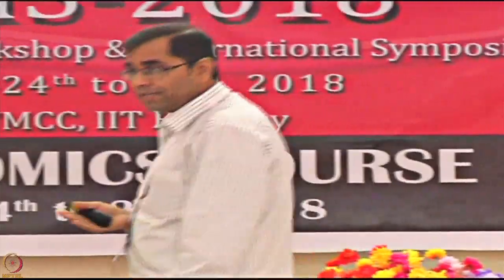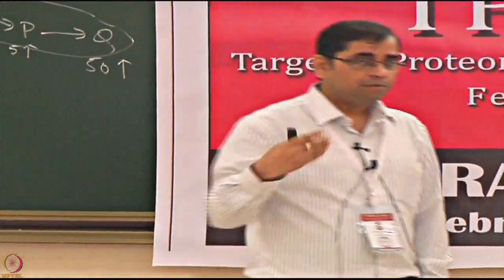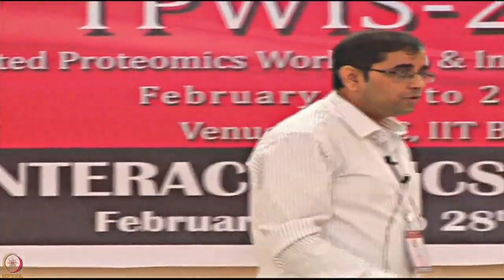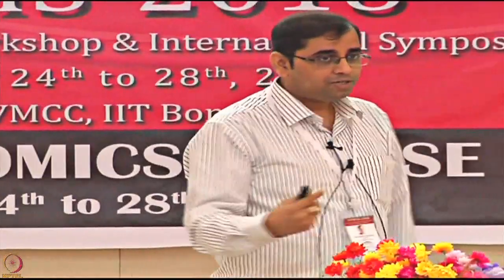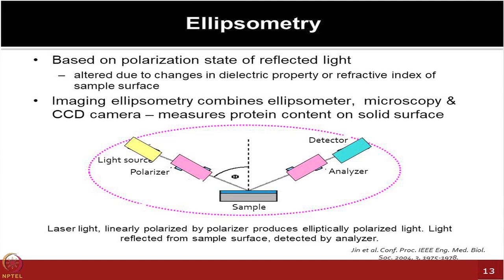These papers were published immediately, and a lot of applications started emerging out of them. It's a simple concept: you are measuring antibody-antigen interactions and looking at the conductance change, and if that can give you some idea that some individuals are carrying antigens which give rise to a certain viral disease, then probably you can do much more specific tests on those.